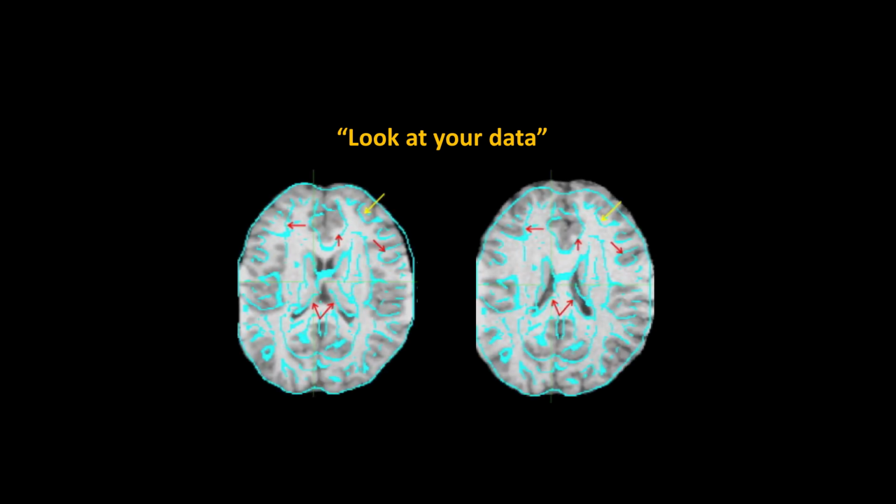Because if we do some more investigating, look at this from a different angle, you would see that actually the one on the right aligns the internal structures, such as the sulci and the ventricles, much better than the one on the left. Now, this one still misses a lot of coverage in the orbital frontal areas. Maybe that's something you can fix with something like field map correction.